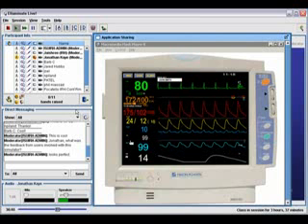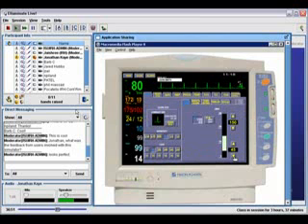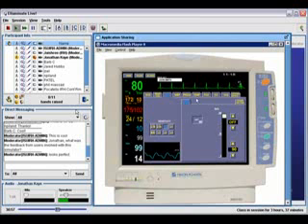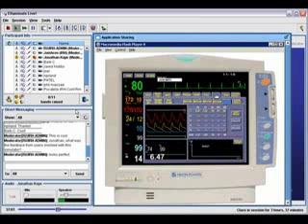But for this example, this machine actually has a lot of things programmed in it. Because we knew exactly what tasks had to be done, I'm just scrolling through a couple of these, maybe a little bit too fast. Because we knew which functions needed to be done and which needed to be consistent, this simulator was much less complicated than it could have been if we had started out thinking we have to duplicate a lot of functionality.